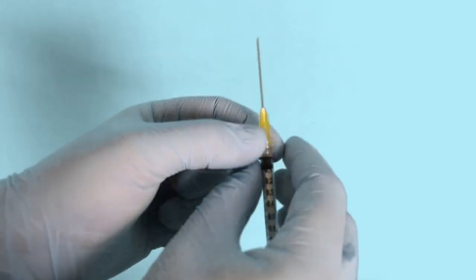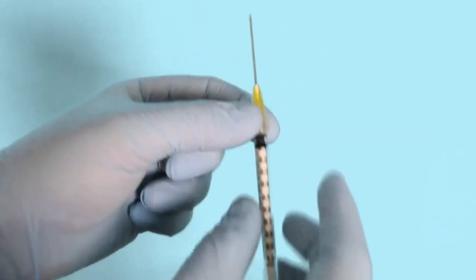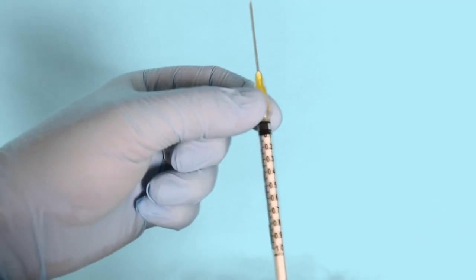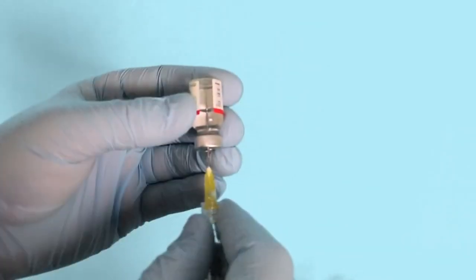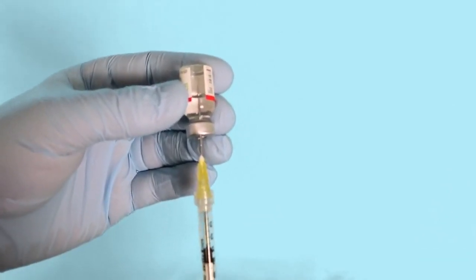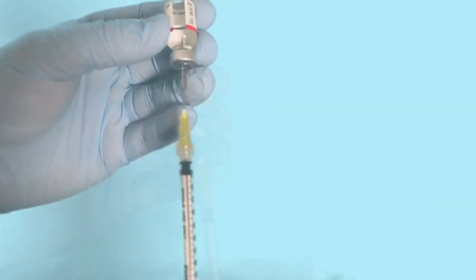The adult epinephrine autoinjector dose is 0.3 mg, so in this case we will draw up 0.3 ml of air before injecting it into the empty space above the fluid line. Then draw up your intended dose.